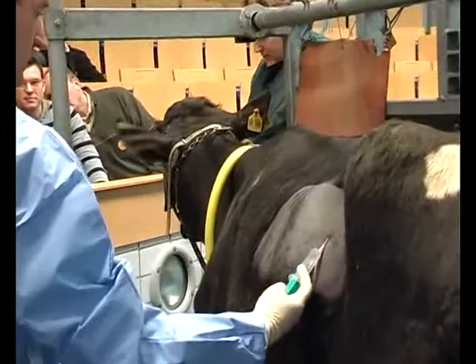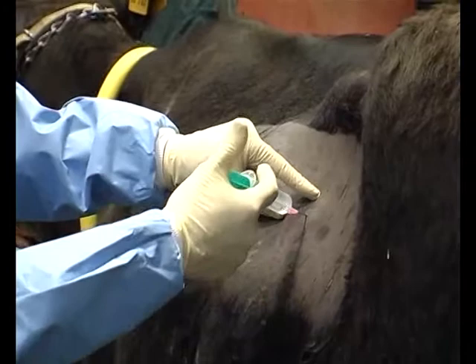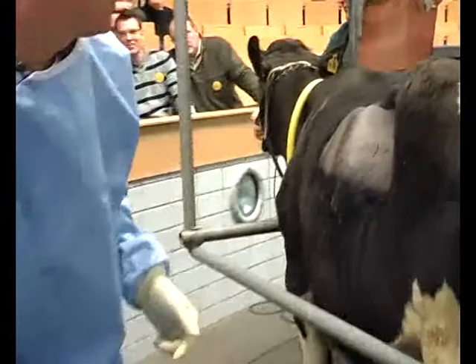This is the place for the scope to get in. And I think here is 20 mil, it's quite a lot. But perhaps I think in an hour I only lose 2.5 mil of local anesthetic. And also here.